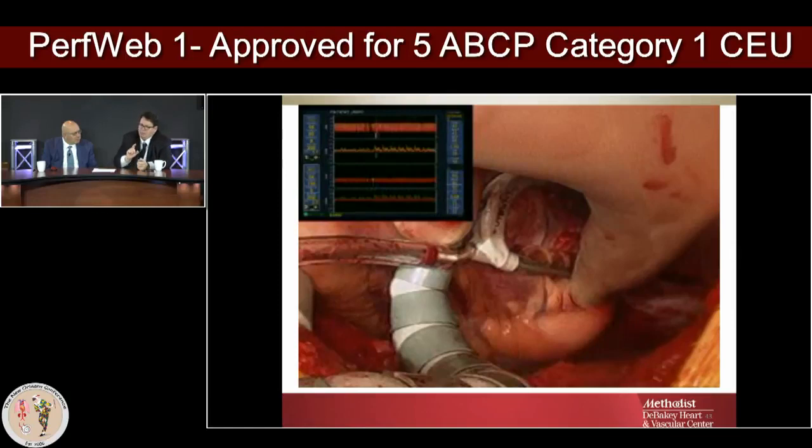And where we say we have a perfect, most sensitive tool to really compare devices, if you just go for the proximal anastomotic devices, I can tell you between the two devices which is better. The one doesn't give you a shower of emboli, but is able to carve out the buttonhole and put your proximal bypass in without the air.